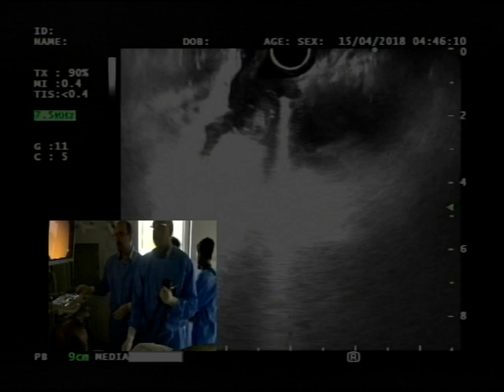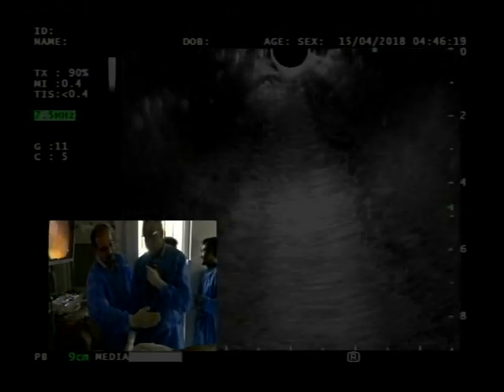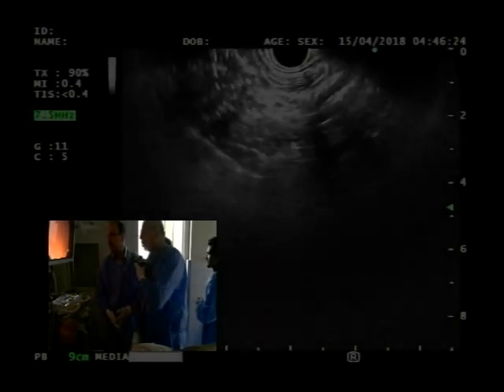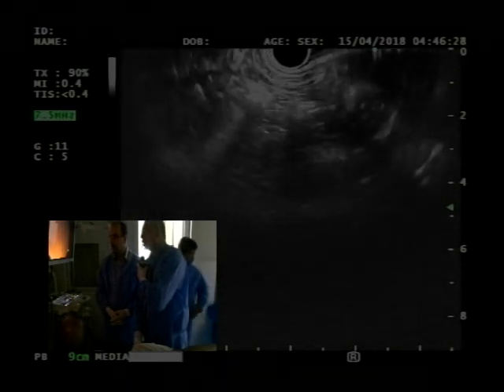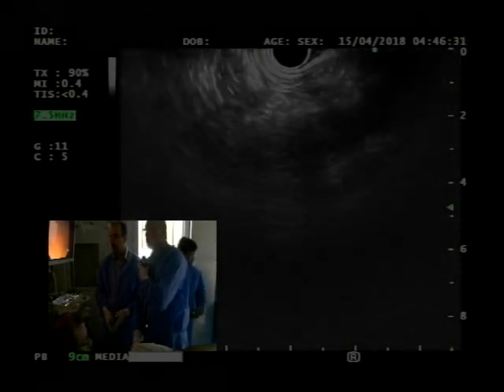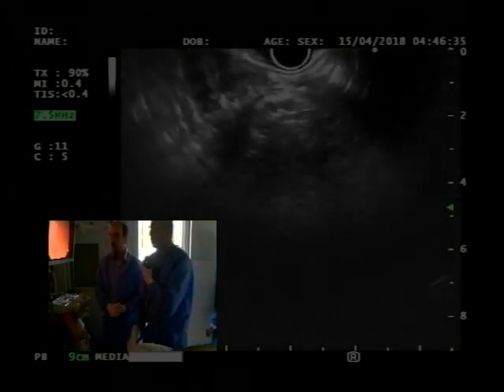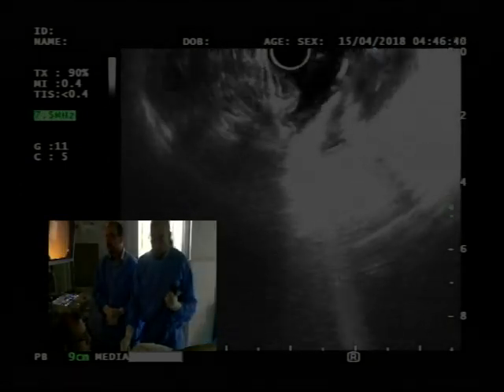This will be, we have to look for the aorta. Exactly. So you're at the GE junction. Your probe is looking down like this. If you turn, you'll get liver, aorta, and then you can identify the branches of the aorta. And if you can't see it, come back, because you will be able to see it from the mediastinum, if nothing else. So you come back and repeat the maneuver again.